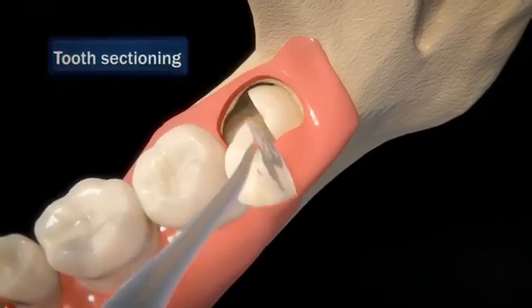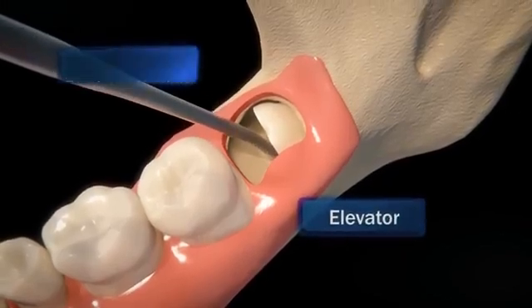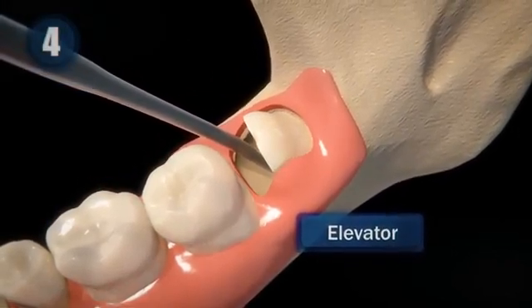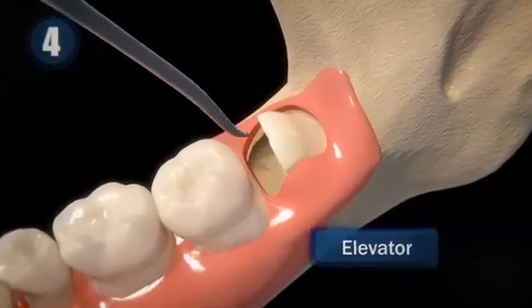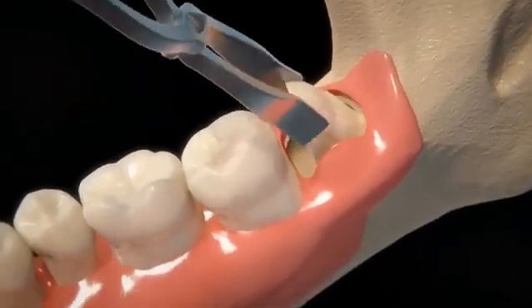which are used to divide the tooth into parts so that extraction is easier, a process called tooth sectioning. Once the tooth is divided, the dentist will use an instrument called elevator to push the tooth out. And then with the help of metal tweezers, the expert will proceed to pull it until it is completely out.